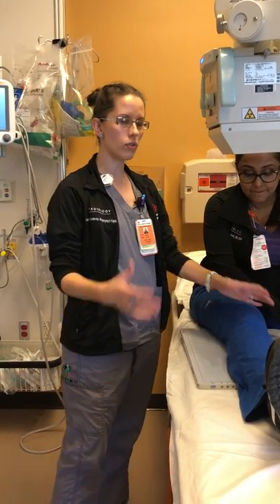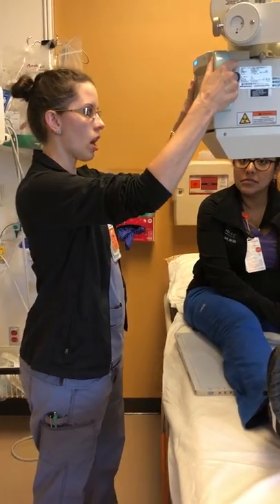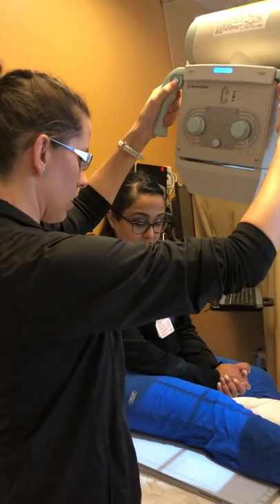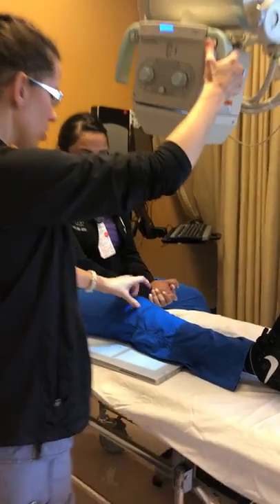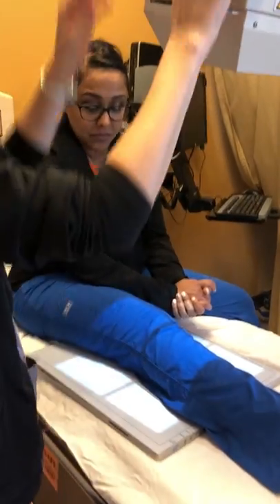If the patient has very thick thighs and thick buttocks with average-sized legs, you need to account for that angulation as well, meaning you apply a five-degree cephalic angle to your tube. Once again, your central ray is one-half inch below the apex of the patella.